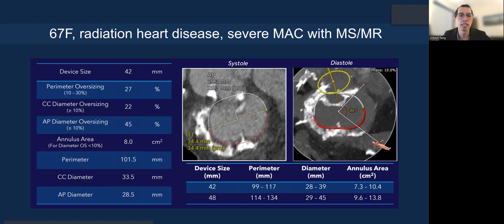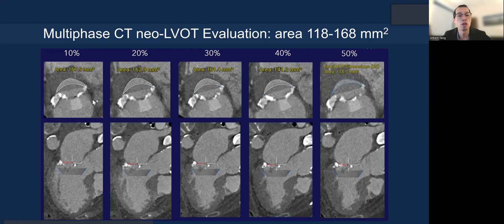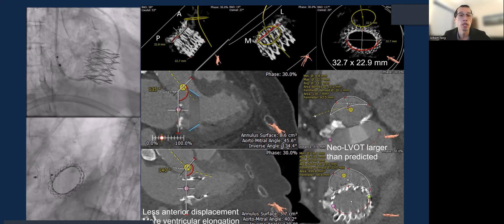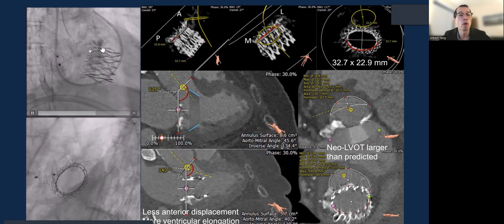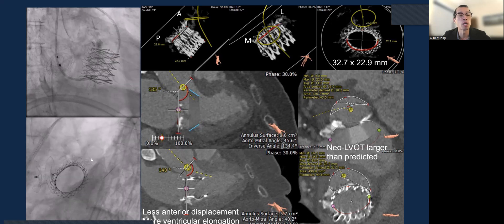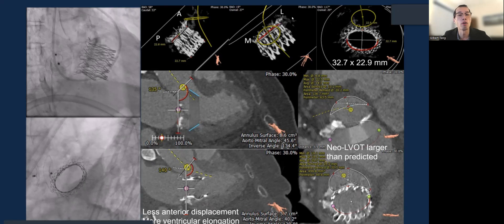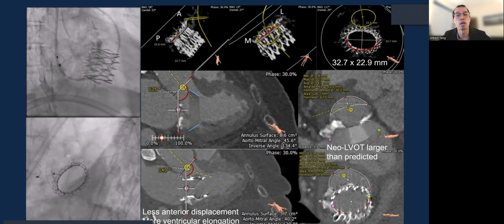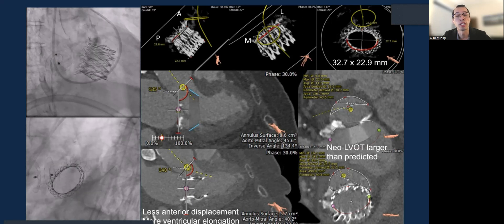Here's an example case: a 67-year-old with radiation heart disease, severe MAC with MS and MR. This is the Intrepid device that has been part of the Apollo trial. The neo-LVOT is quite borderline — only around 160 mm² with systole at near 120 mm². There's certainly a concern about LVOT obstruction. However, at that time the screening criteria was different, so we actually treated this patient, and it went very well. On fluoroscopy you can see the annulus is actually quite ovalized, and on post-CT the AP dimension is only around 23 mm, despite the annulus expected to be at least 27 to 28 mm.